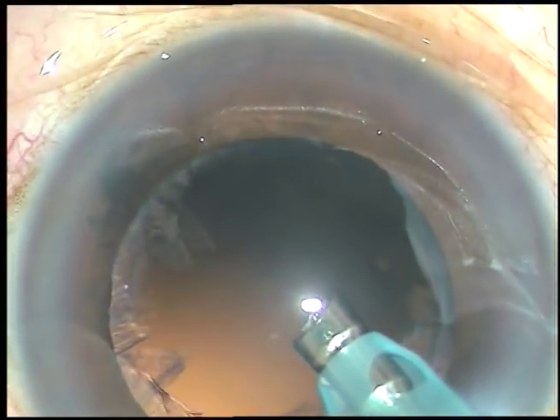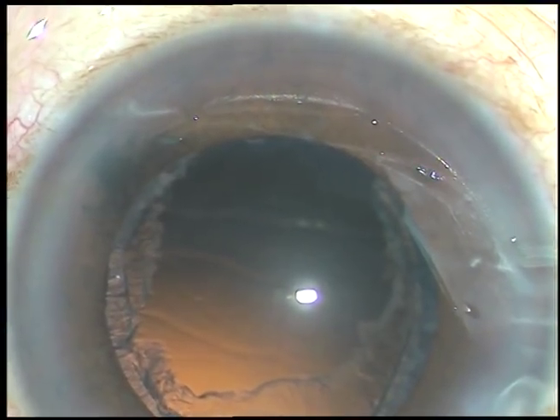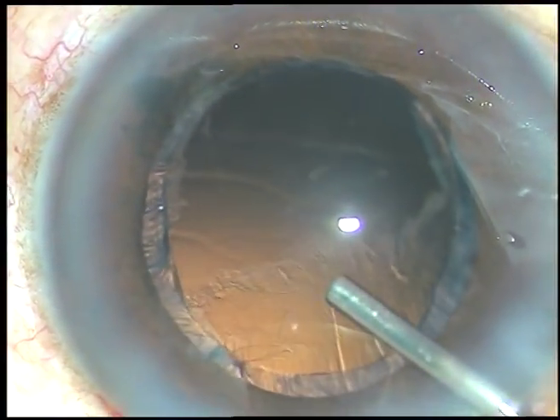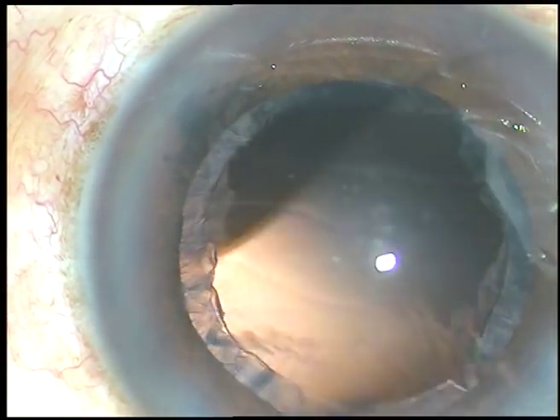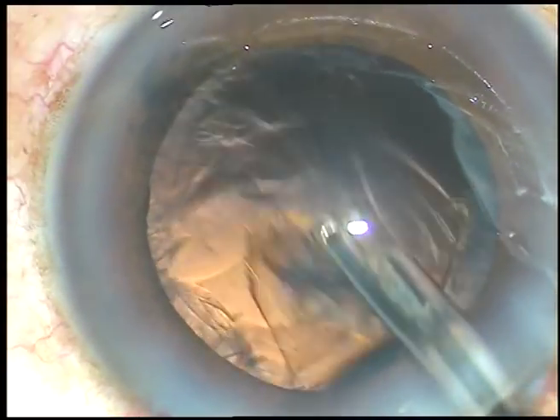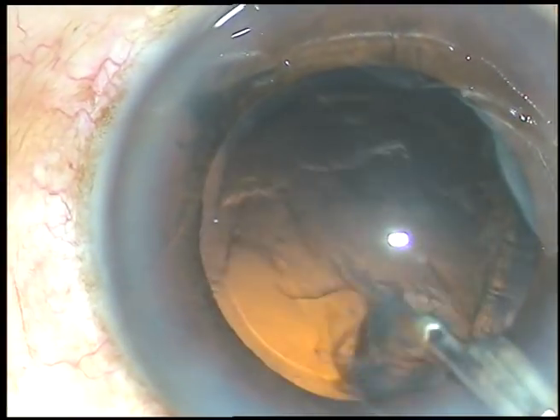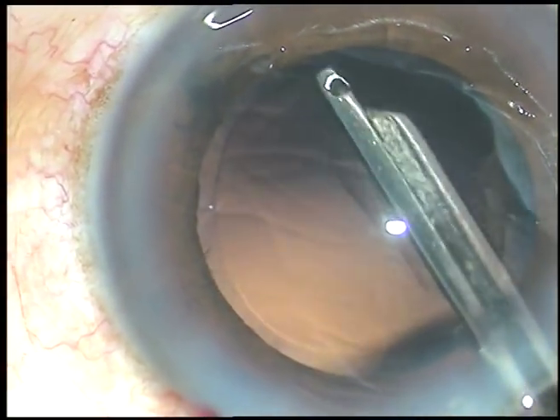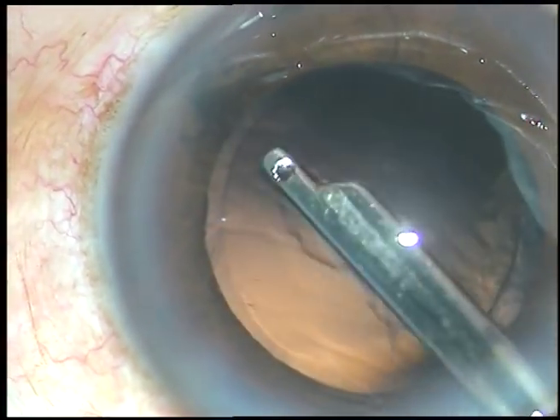Now, this is the last piece of cataract. It was an epinuclear piece. And this is a little bit of cortex remaining. I inject some viscoelastic substance because I use SIMCO through the main port. If there is viscoelastic substance in the anterior chamber, the anterior chamber remains formed for some time because the viscoelastic substance comes out gradually, and you get some time for cleaning the cortex.